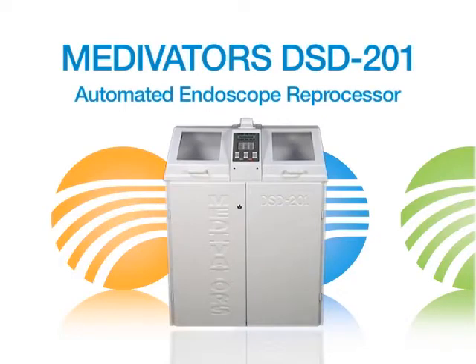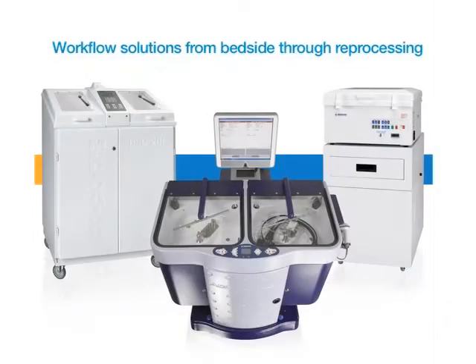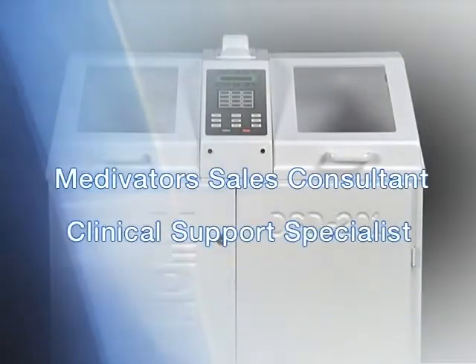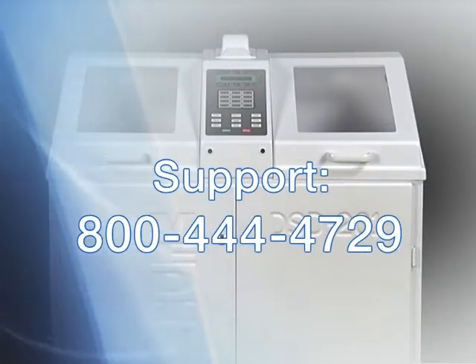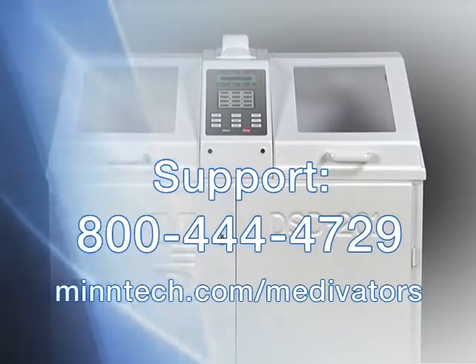This is the DSD-201 Automated Endoscope Reprocessor from Medivators, a Minntech Corporation business group. Medivators provides workflow solutions in endoscopy from bedside through reprocessing. Your Medivators Sales Consultant, Clinical Support Specialist, and Field Service Engineer may be contacted by calling 1-800-444-4729 or by visiting our website at www.minntech.com.